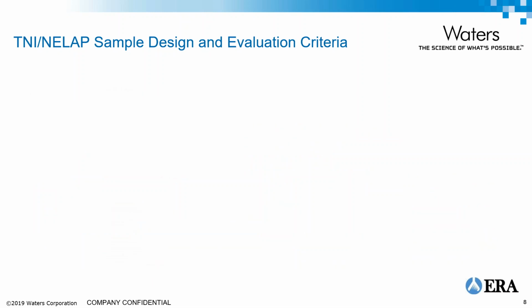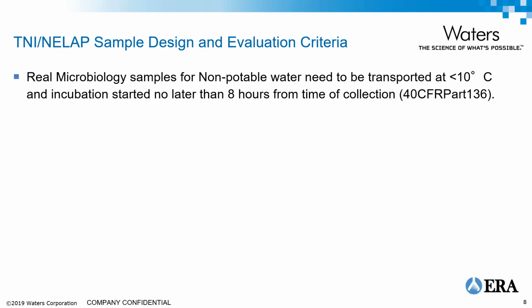All right. So any discussion when you're talking about a PT sample in the design, I think you need to start out by recognizing that microsamples are unique in the PT world in that you're analyzing organisms that are going to change. So there are pretty strict requirements when it comes to transporting the sample and the amount of time that can elapse before you have to actually get the analysis started. So I'm quoting some info out of 40 CFR here just to put that into perspective.